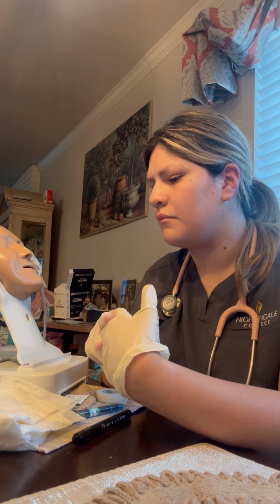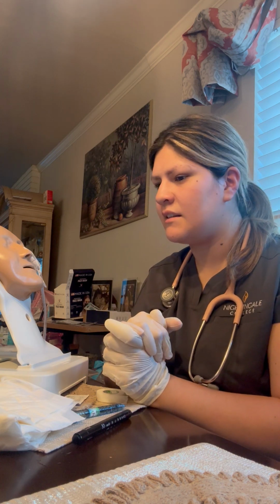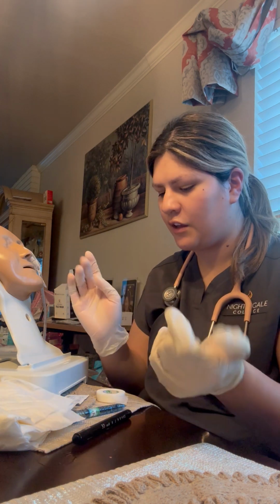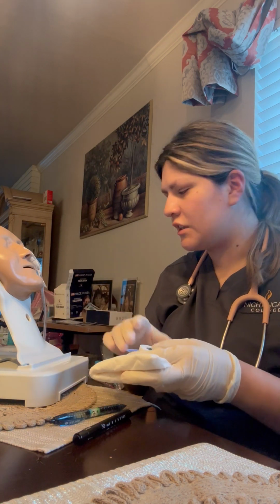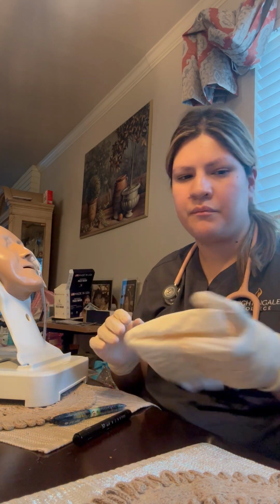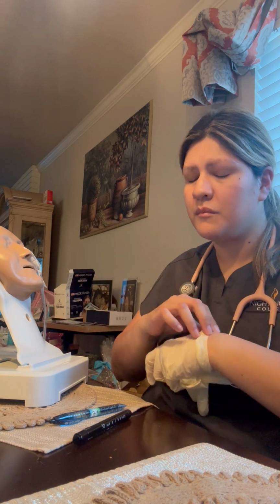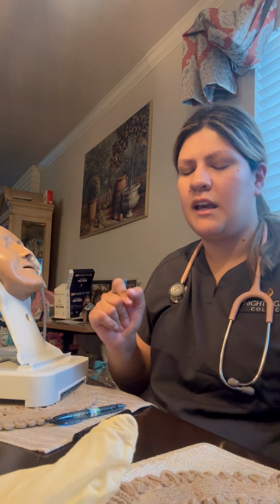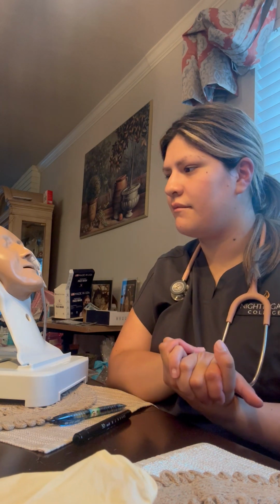Okay, Mr. Smith, well, that is everything. Thank you. You tolerated it very well. So you're going to get rid of all your stuff. You would take off your gloves and dispose of them, perform hand hygiene, and see yourself out. Thank you.